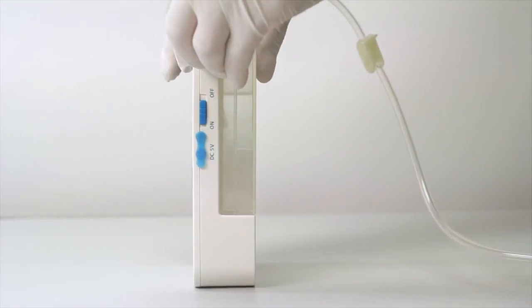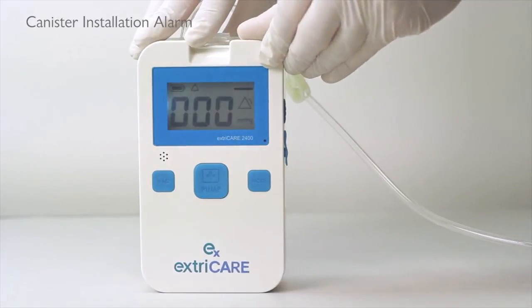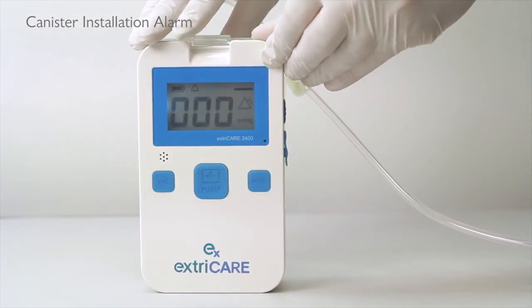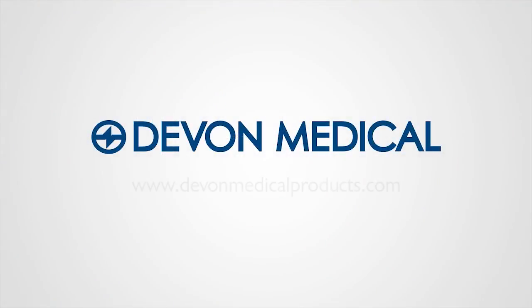If the canister is not detected or installed correctly, the ExtraCare will not operate. The alarm will sound and the LED light will flash yellow until a canister is installed properly. Thank you for your interest in our ExtraCare Negative Pressure System.